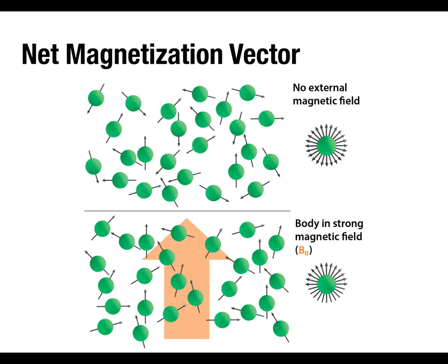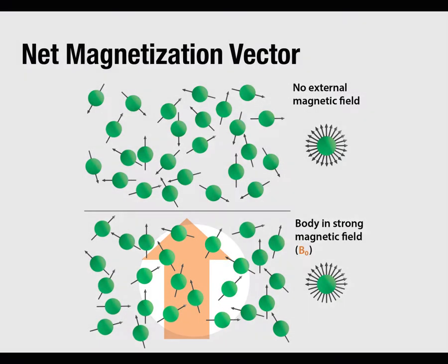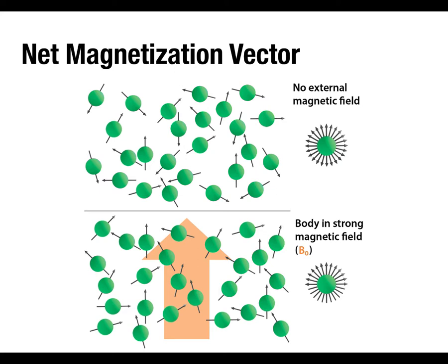And it's important to realize this is a 2D picture, right? But these can be oriented in 3 dimensions, really. Inside a strong magnetic field, the protons don't all magically line up perfectly because there's a lot of other forces impinging on them.